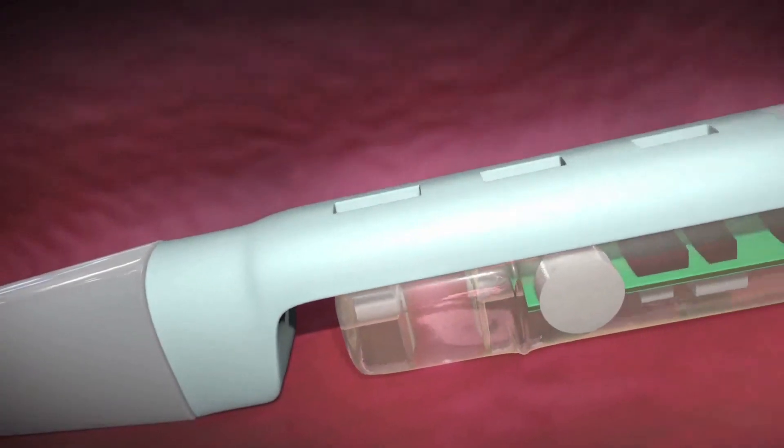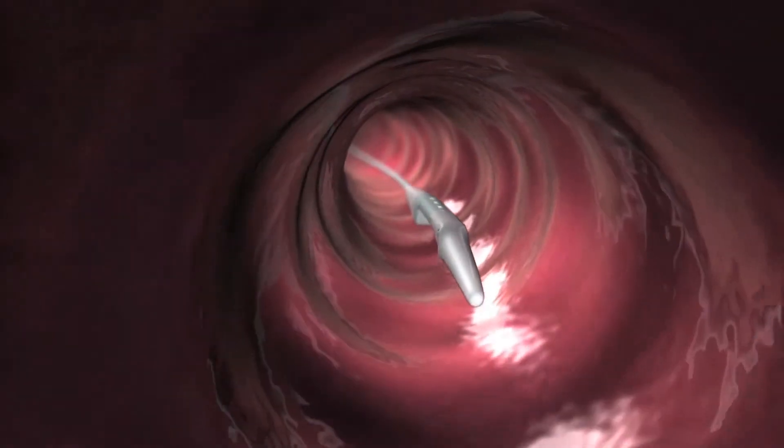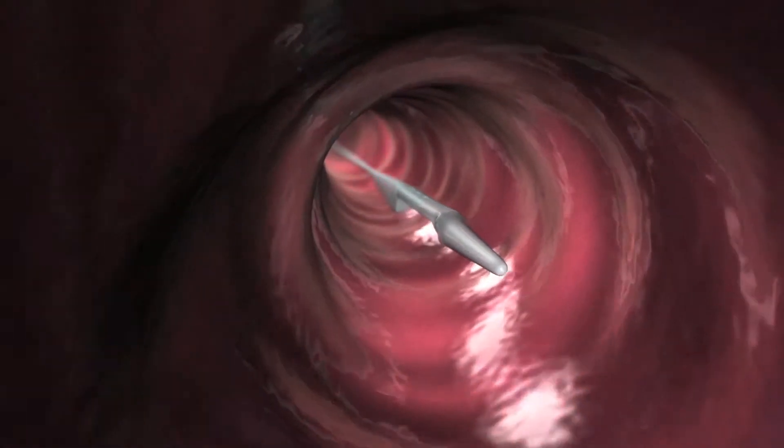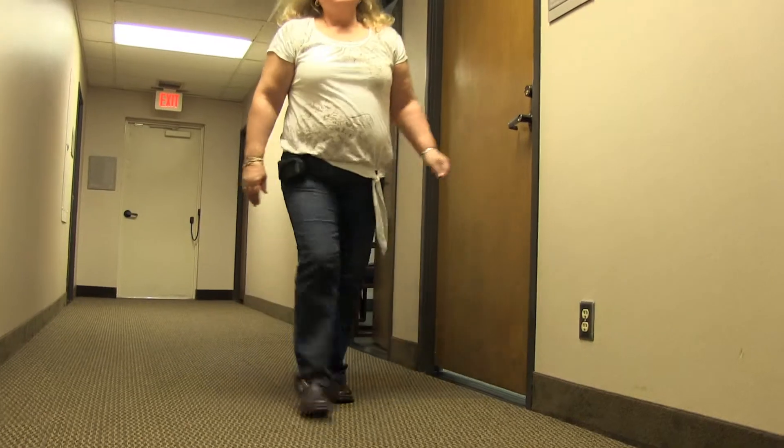The Bravo system involves a PH capsule about the size of a gel cap that is temporarily attached to the wall of the esophagus. The Bravo PH capsule measures PH levels in the esophagus and transmits the data via radio waves to the Bravo receiver worn on your belt or waistband.